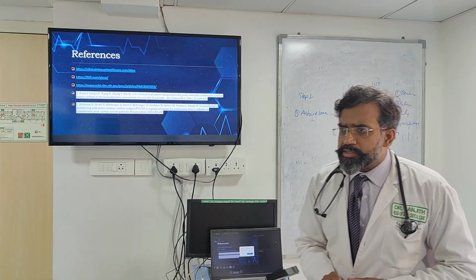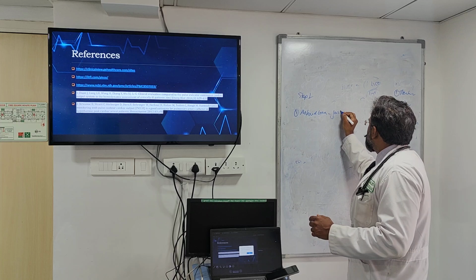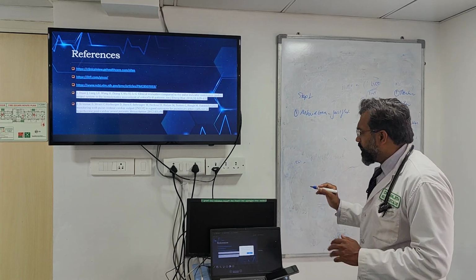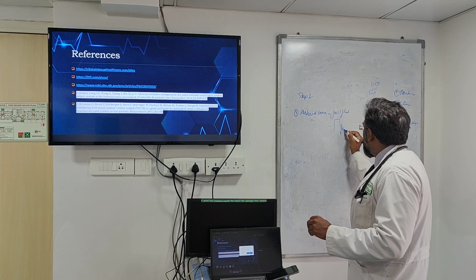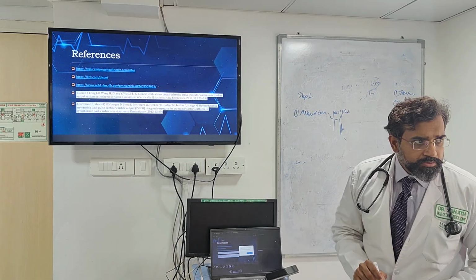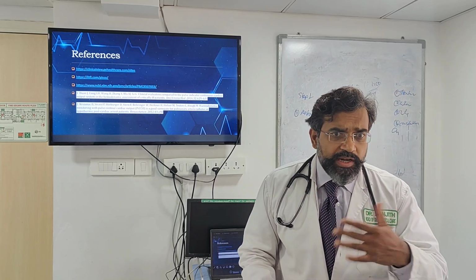How do I check my arterial trace? You do a fast flush test. A fast flush test should ring in the right way, which means that it should go up, come down and have two small bounces, with the second bounce smaller than the first bounce. It should show this procedure. That is for any arterial line.